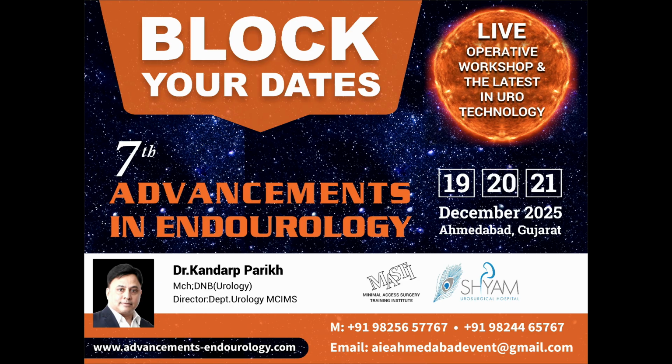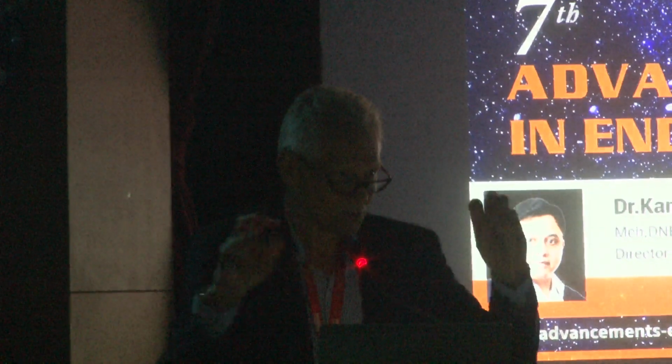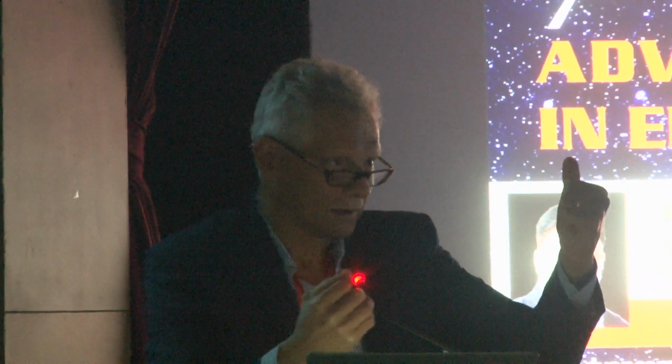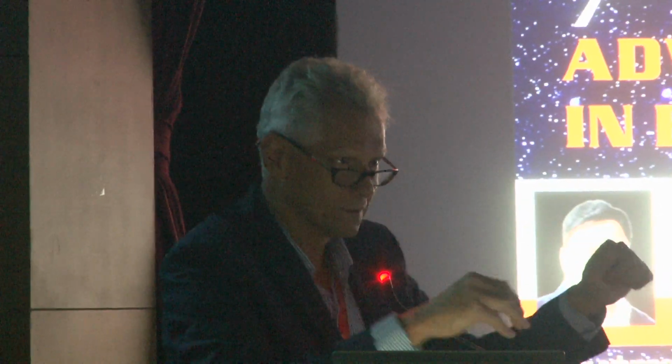So it's a very good question, because sometimes you can have this. Normally I show you some small video, but it's great. If you have a small hole in the peritoneum while you are doing this, what is important is to enlarge it immediately. If you just leave it as a small hole, then you will always have, during the surgery, the pushing of the peritoneum. If you have a small hole, go inside with the scope, you enlarge, and then it's a mixed approach, in fact.